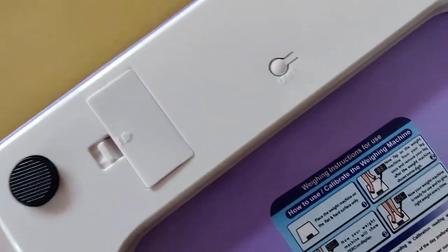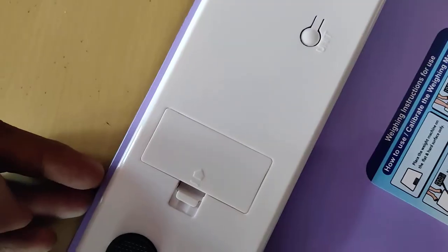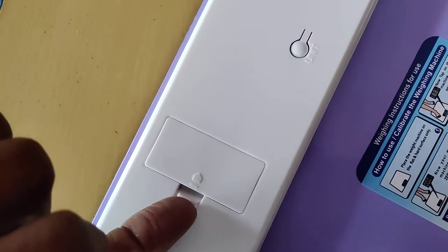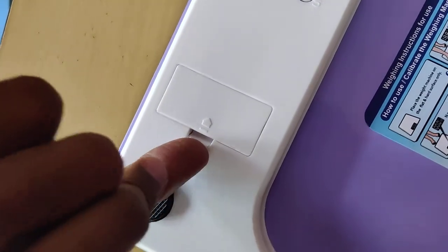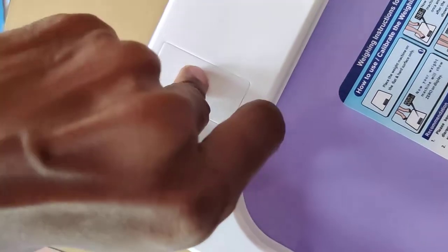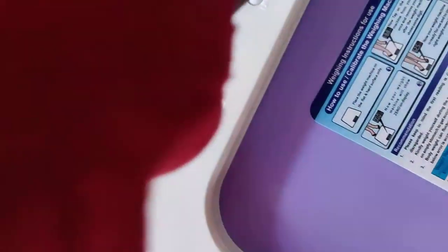Here you can see the battery slot. You must simply lift this using your finger or your nail — just simply lift this arm like this. Now it's open.